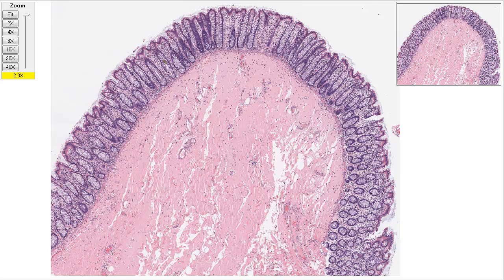This is Sal here, and I'm at Stanford Medical School with Dr. Andy Connolly, who's a pathologist here. And this is the second in our series on looking at some of these slides.